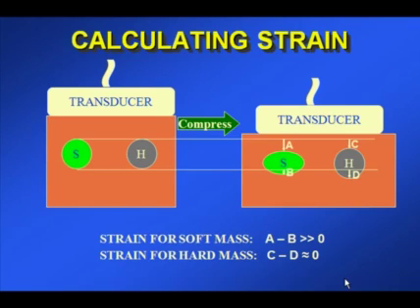So you can see soft lesions produce a larger strain value than do hard lesions, because with a hard lesion, the back edge displaces the same amount as the front edge pretty much, and so you have virtually no difference in the displacement, thus the strain is almost zero.